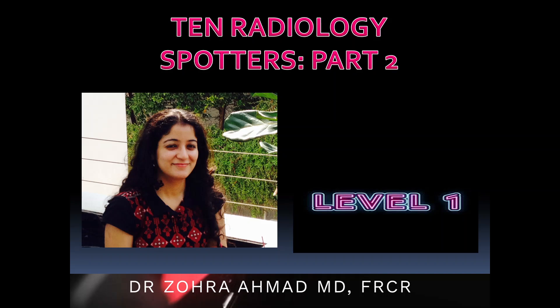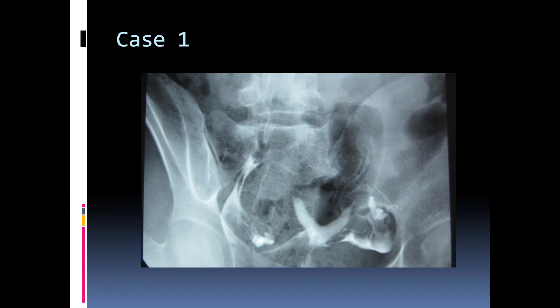I'm Dr. Zora Ahmed and I will be discussing 10 radiology spotters or antinies which will be useful for people preparing for MD, DNB, or FRCR exams. The first one is an HSG or hysterosalpingography, and here we see two widely separated uterine cavities with an intercornual angle of approximately 100 degrees, and this is a bicornuate uterus.